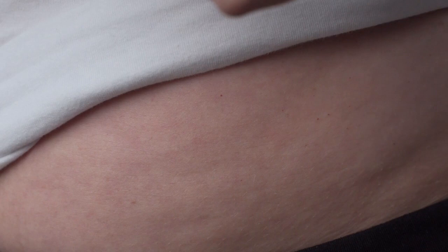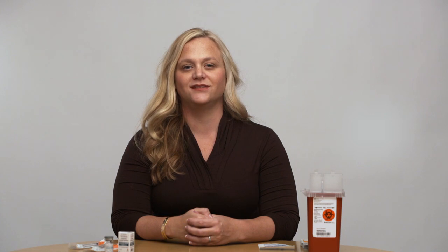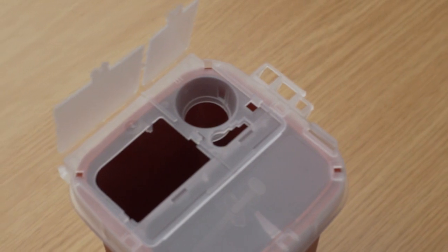Gently withdraw the needle and apply pressure to the injection site with a sterile gauze pad. If necessary, apply a band-aid to the injection site. Once your injection is complete, dispose of the used needle and syringe in your safety container.